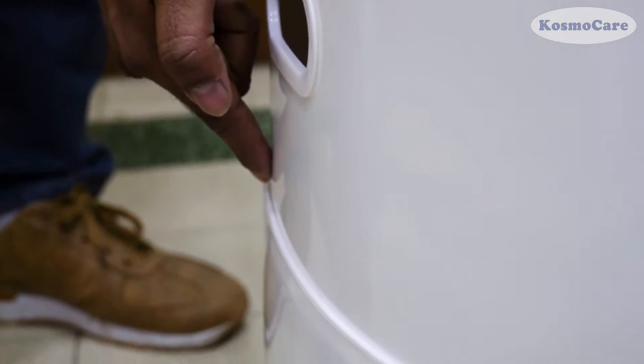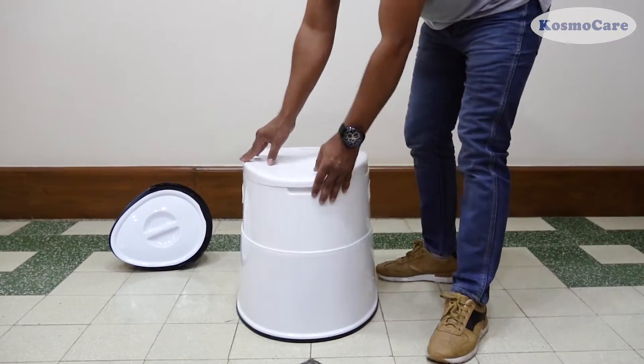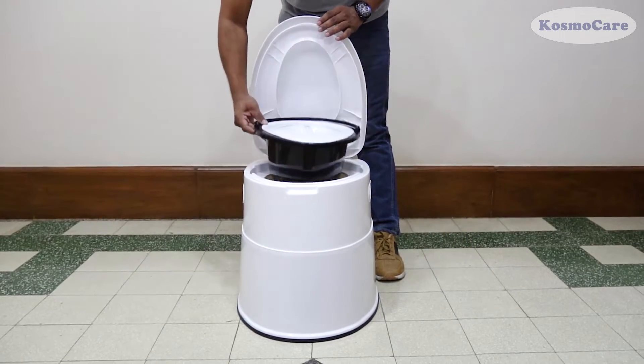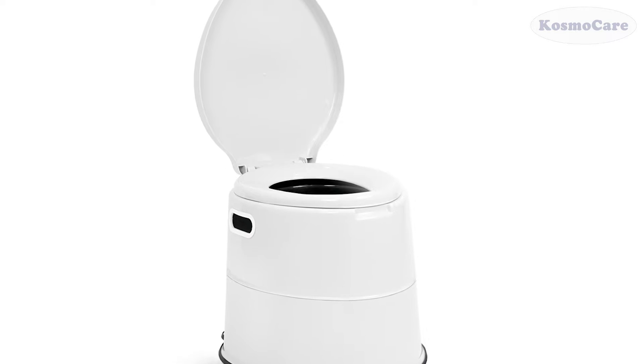Ensure that the commode is locked from all the sides before use. Place the commode bucket in the inbuilt commode bracket, and the KosmoCare Portable Commode Toilet Stool is now ready to use.